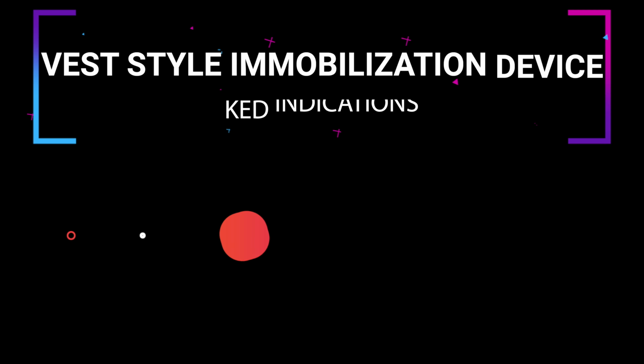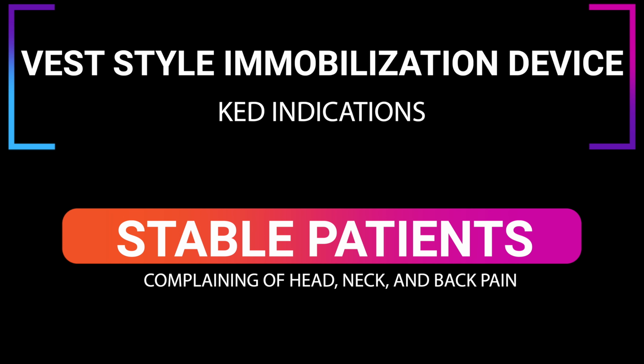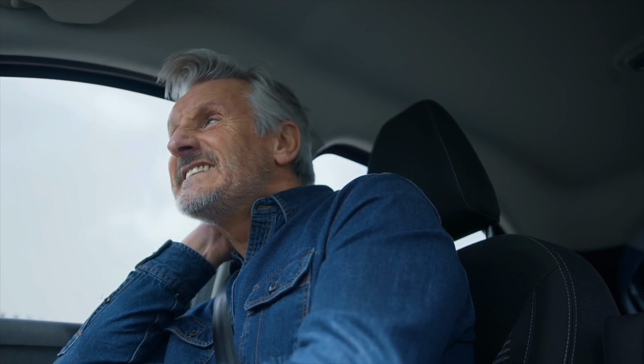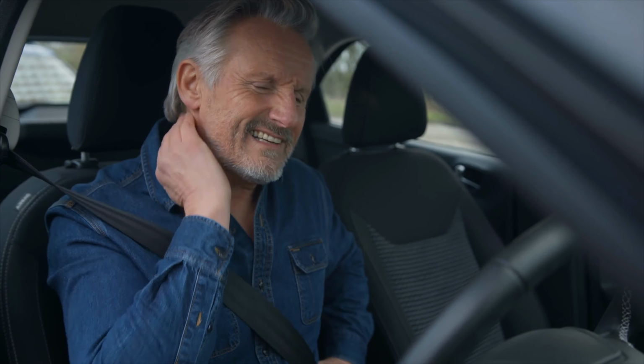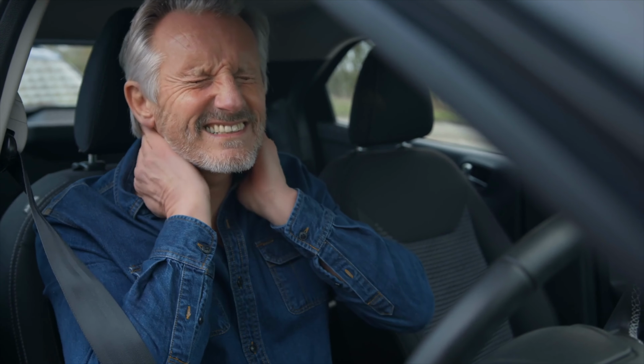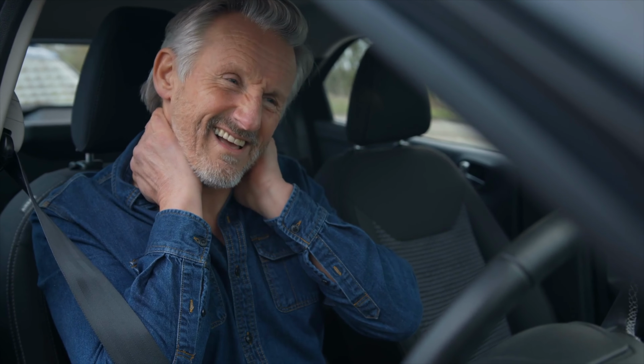So, to clarify, the vest-style immobilization device, or KED, should only be used in stable patients who are complaining of head and neck pain and who are in an environment with no immediate safety threats. Why? Because KED application can be a lengthy, involved process, as you are about to see.